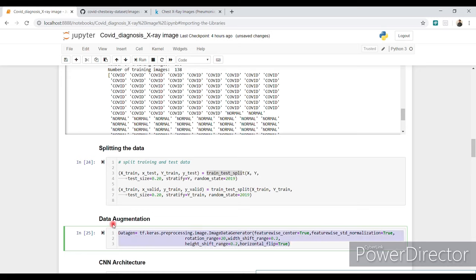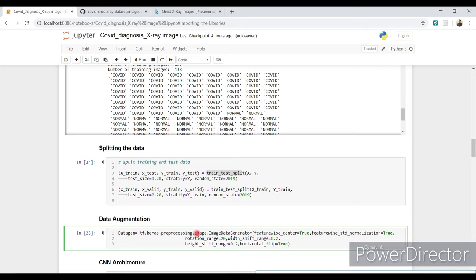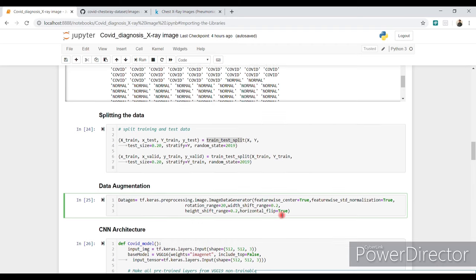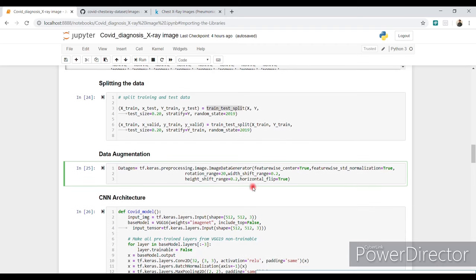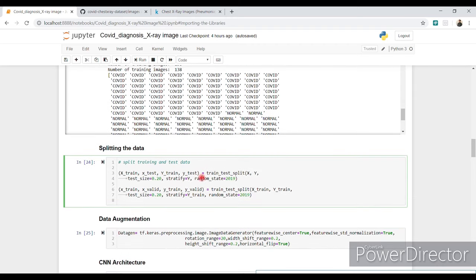For data augmentation we use 'tensorflow.keras.preprocessing.image.ImageDataGenerator'. If you don't use this data augmentation step you will get a dimension mismatch error. After that, run the next two cells as well.